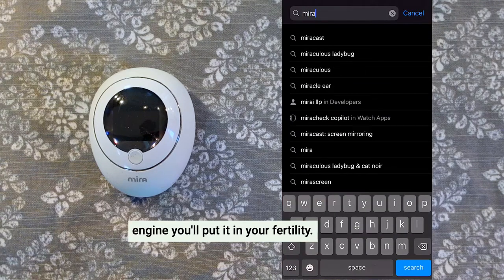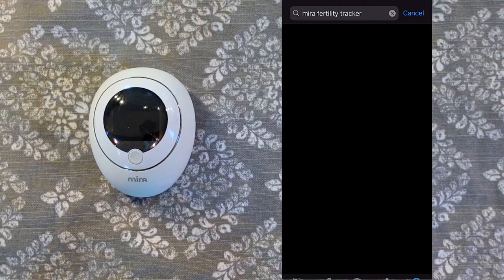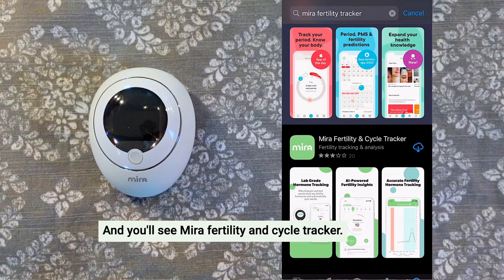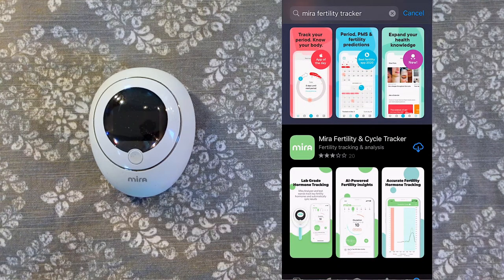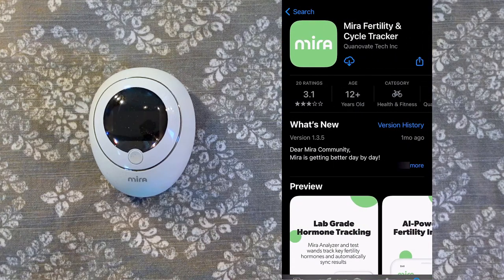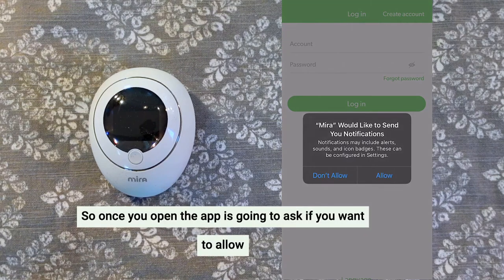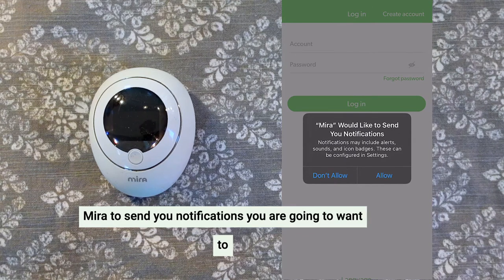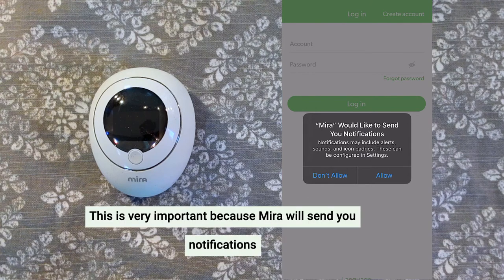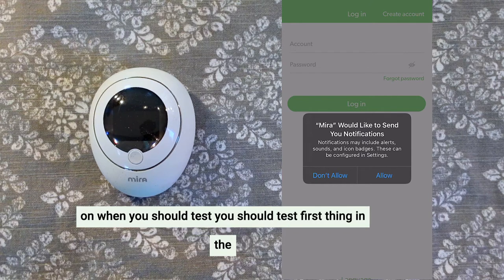In the search engine, you'll put in Mira Fertility and you'll see Mira Fertility and Cycle Tracker. You're going to want to go ahead and download this app. Once you open the app, it's going to ask if you want to allow Mira to send you notifications. You are going to want to hit Allow.